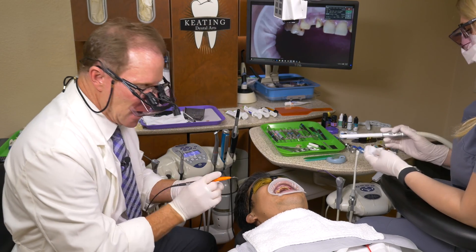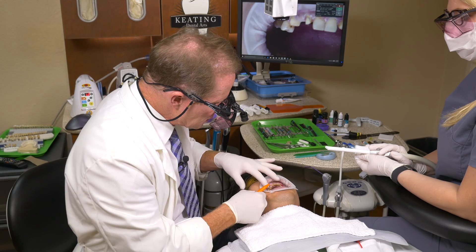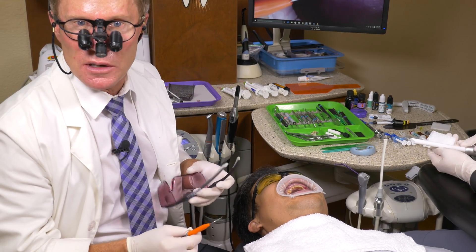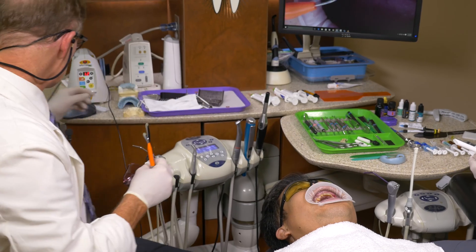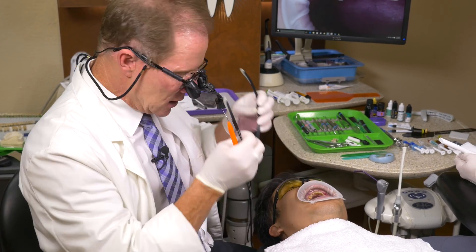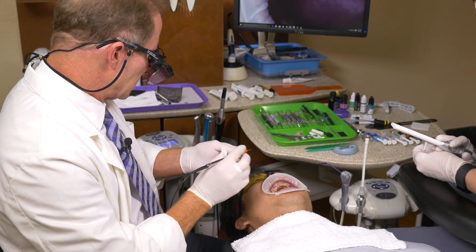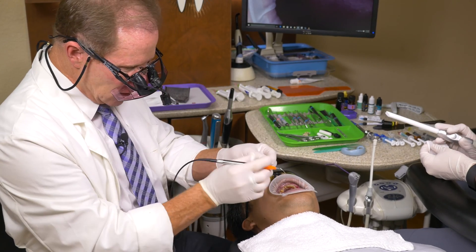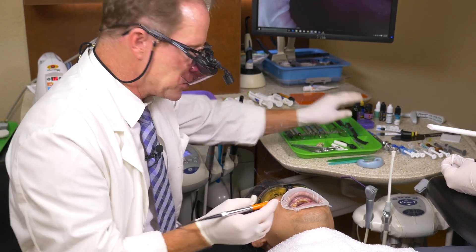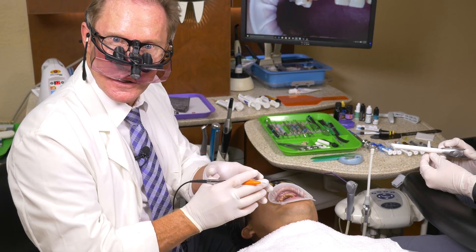When we're making a cut, we actually initiate the tip and we're going to use pretty low energy. Kenny is Vietnamese — he's got a lot of melanin in his tissue, and the diode laser is attracted to dark pigmentation. So the more melanin, the lower the energy. I'm actually going to start at 1.2 watts, and this is continuous wave with an initiated or activated tip. The way we activate that tip is we put it in a little articulating paper — you can use a Sharpie felt pen or a cork. What it does is put dark pigmentation on the end of that laser tip, and then it'll focus the energy of the laser.